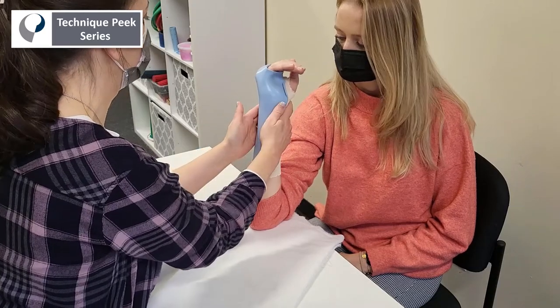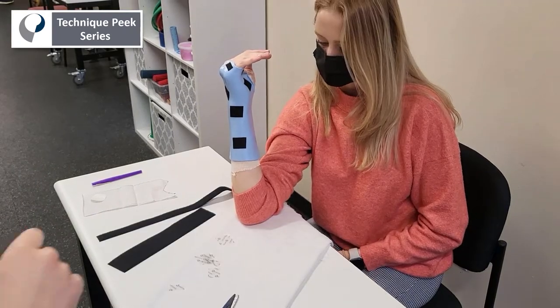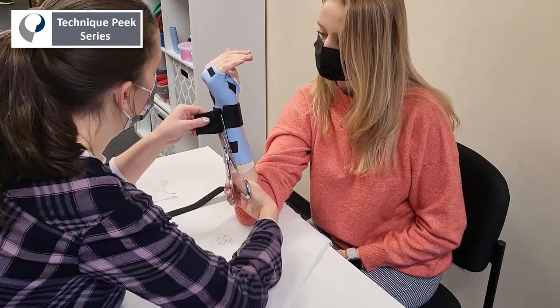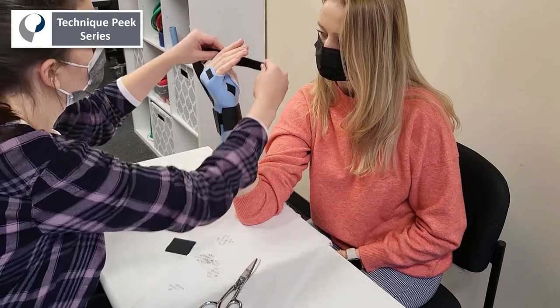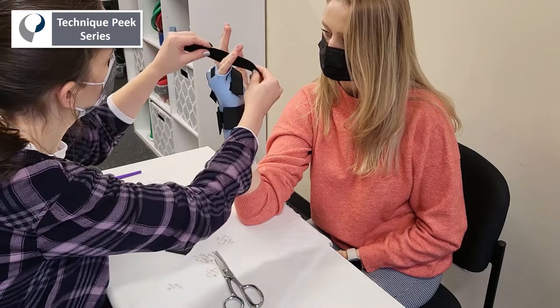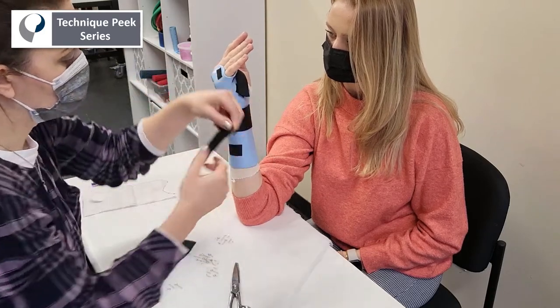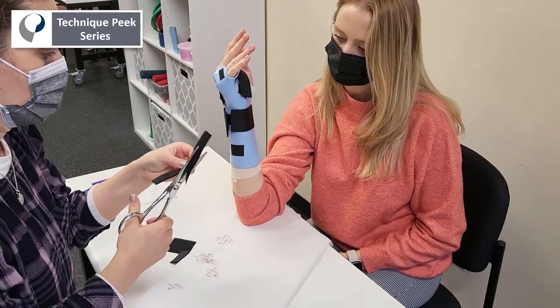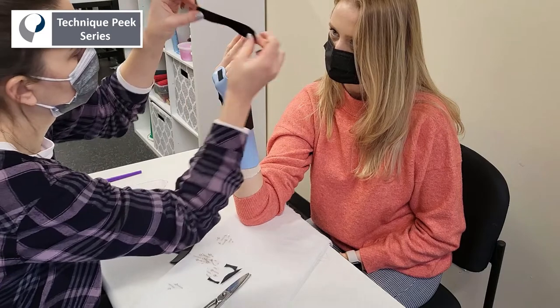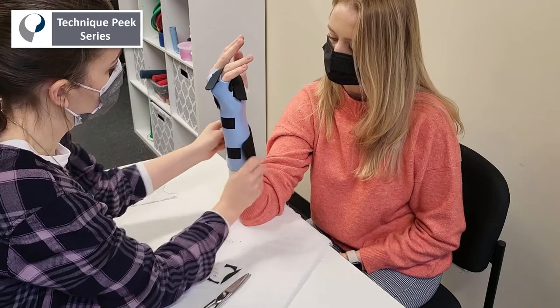For MCP joint flexion, I like to shoot for that 50 to 70 degree sweet spot. Next, we're going to add our straps — two proximal straps, one at the wrist crease and one further down. Then we're going to use one strap in between the thumb web space, and the last strap is going to be in between the two fingers included in the splint. We're going to do a half moon cutout to make sure there's no irritation in between the last two fingers, and round the edges for a finished product.